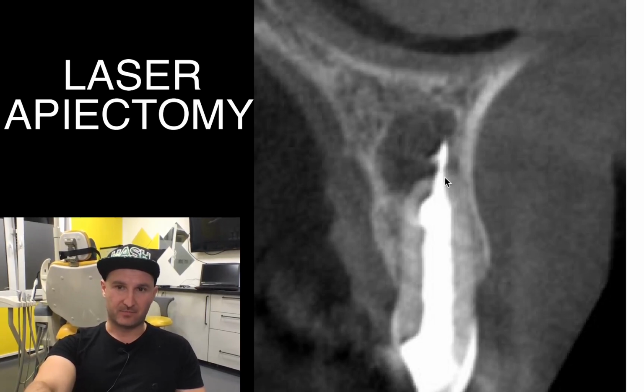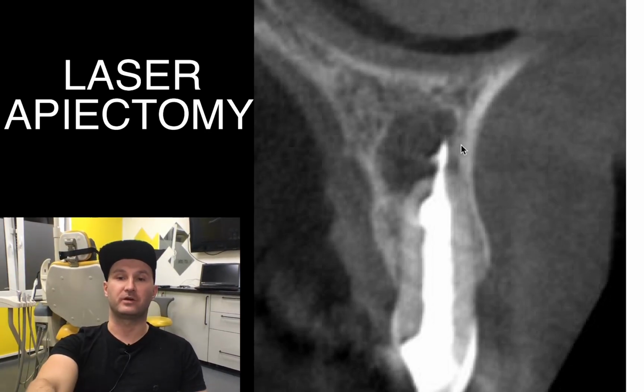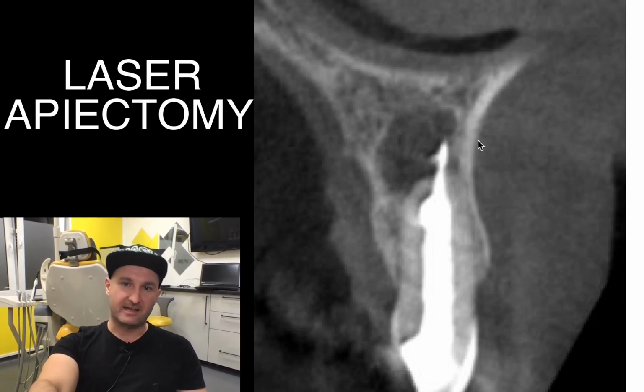And in case removing of this filling material from outside of the apex will not be possible, then we will proceed in the same session with apiectomy, with endodontic microsurgery, which will let us to remove extruded material and additionally to remove granulation tissue and disinfecting this area.